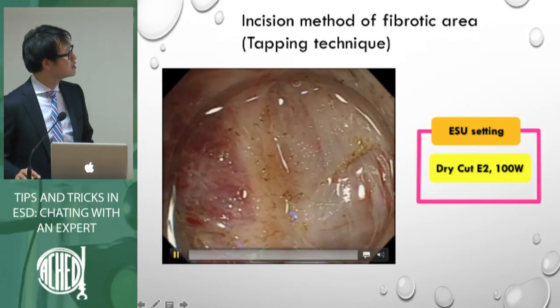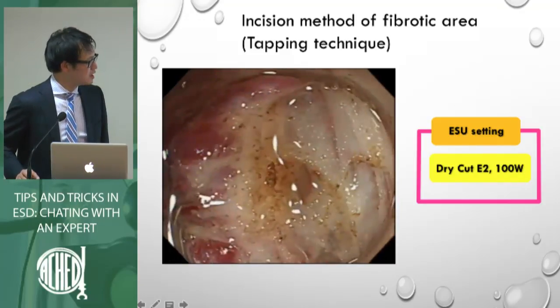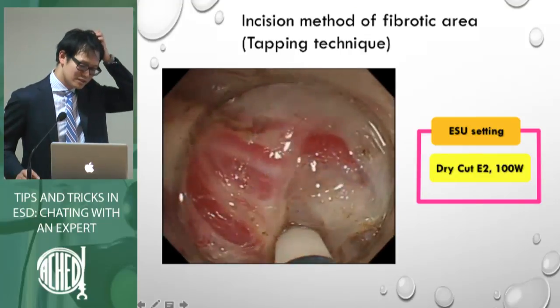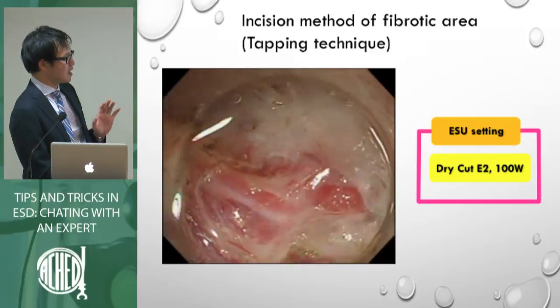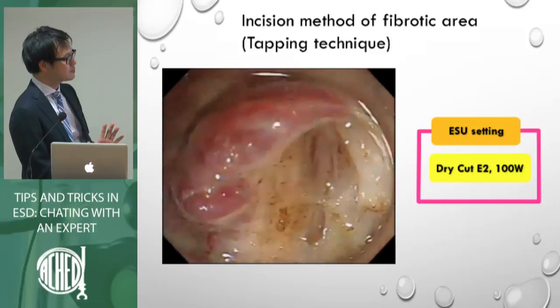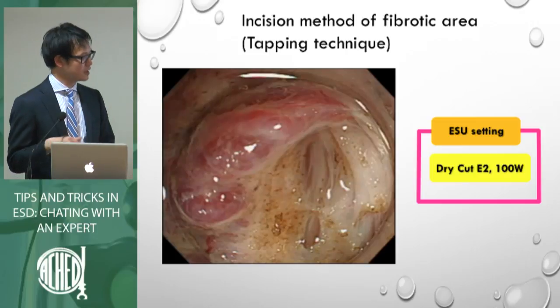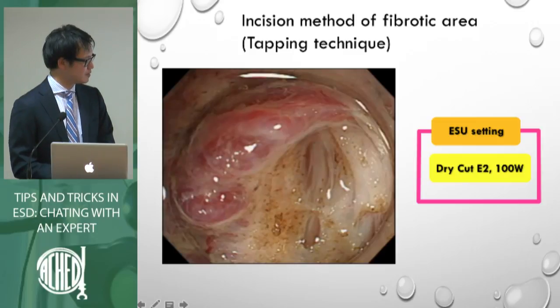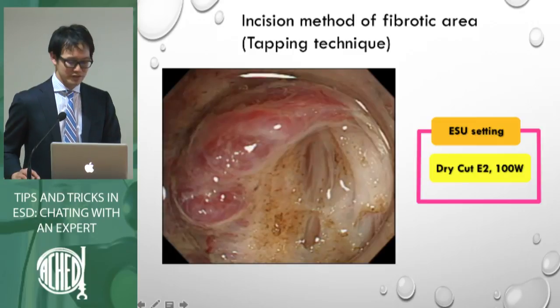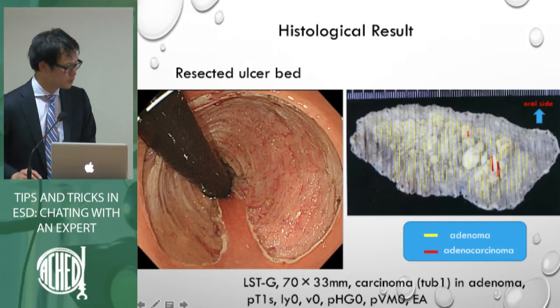So this is a fibrotic area. We use dry cut, so it is important to choose the appropriate setting. We usually think about the ESU setting. ESU setting is one of the important factors, how to use the ESU settings. So finally, it can be resected by complete resection.